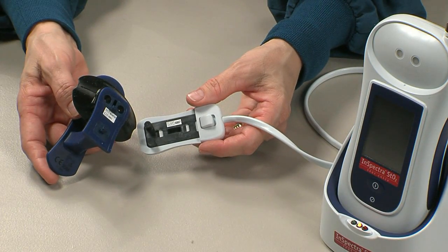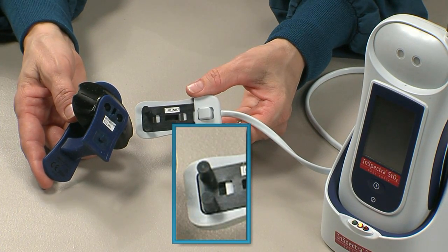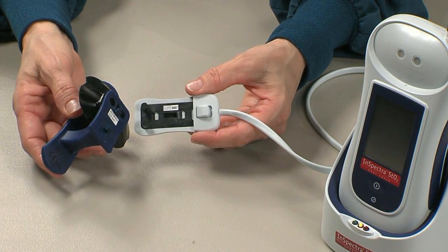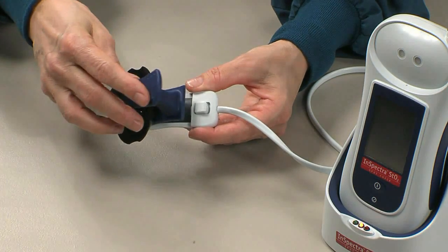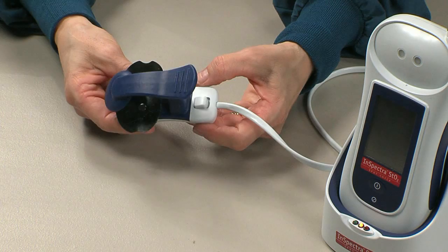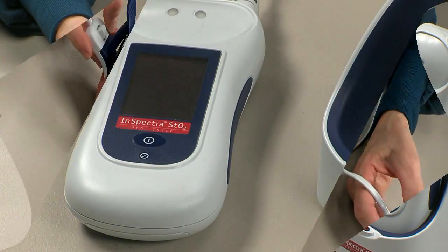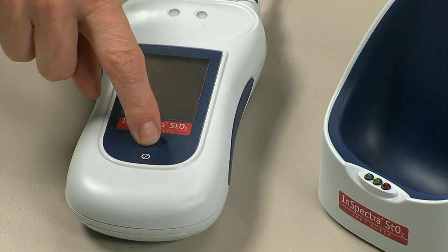Now, connect the reusable InSpectra STO2 clip. Insert the two prongs on the InSpectra STO2 cable into the two holes on the top of the clip. Press the cable and clip together to click into the locked position. Ensure there is no gap between the cable and the clip.